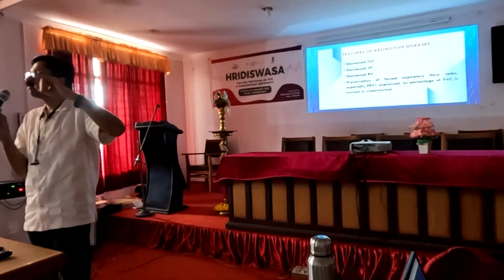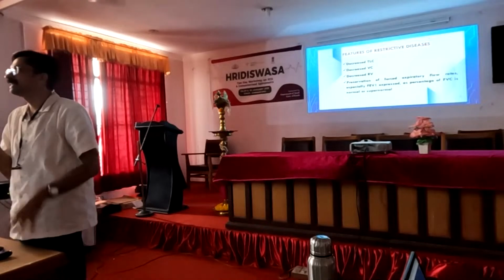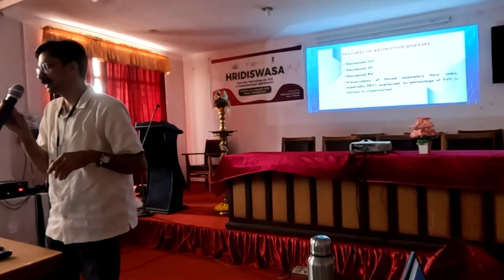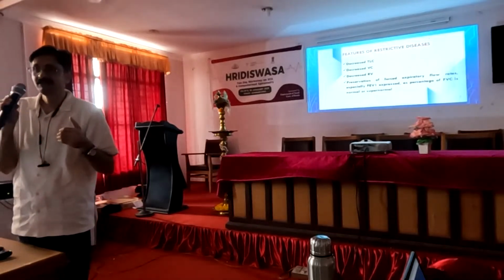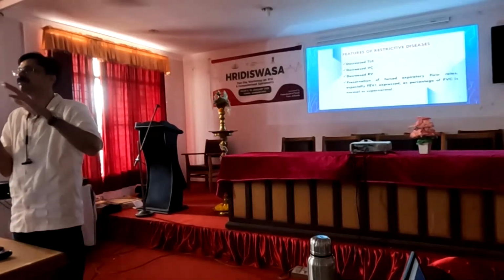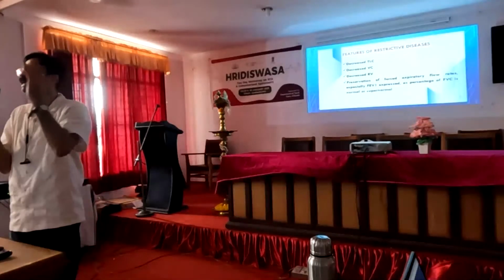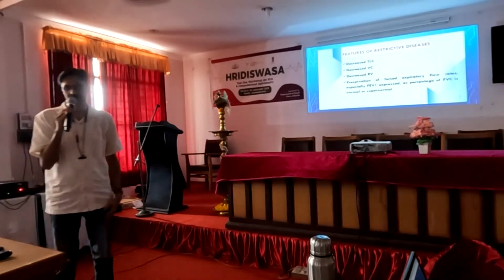So the residual volume, then the functional residual capacity, these are not measured by the spirometer. These are non-spirometric lung volumes. The residual volume plus expiratory reserve volume is the functional residual capacity, so it is not measured by the spirometer. Total lung capacity we also can't assess through the spirometer because it includes the residual volume. All other capacities and lung volumes we can get through the spirometer.